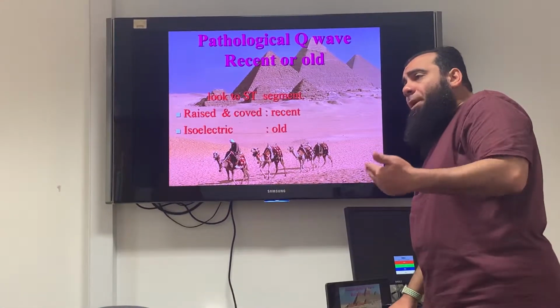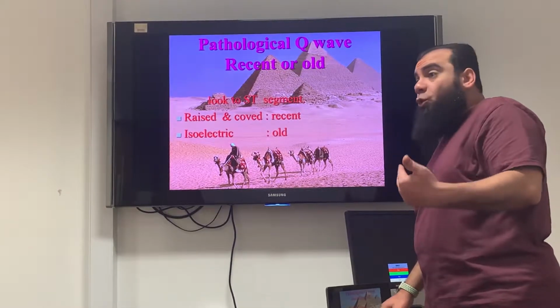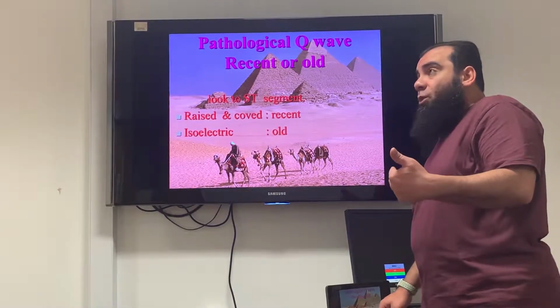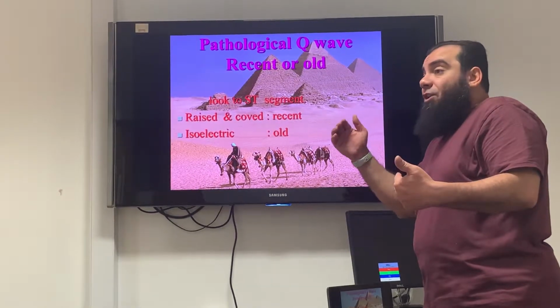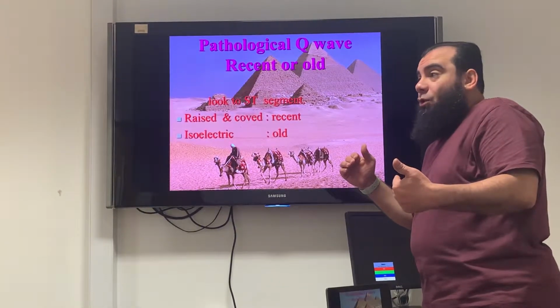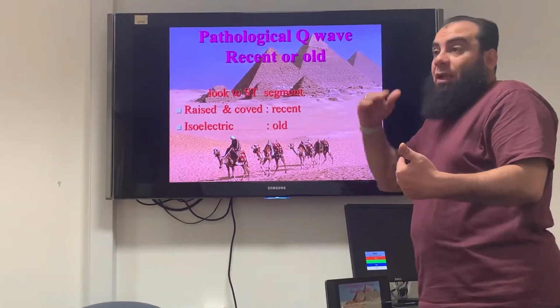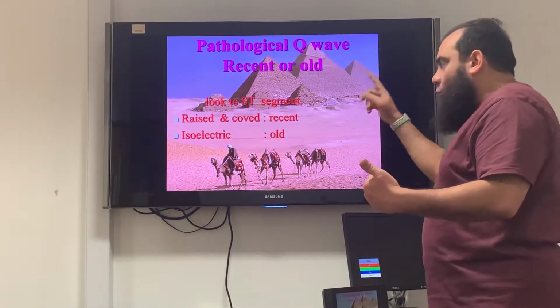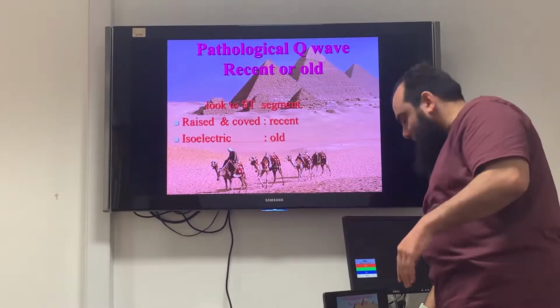Because some people compare the ST with the previous PR, which is wrong. They usually do it. But as we discussed, the PR can have an elevation and depression as well. So it's unfair to compare it with the PR, because it's not an isoelectrical gap. It can deviate. And I'm going to repeat it again in that lecture. Not that lecture, the next one, which is today.